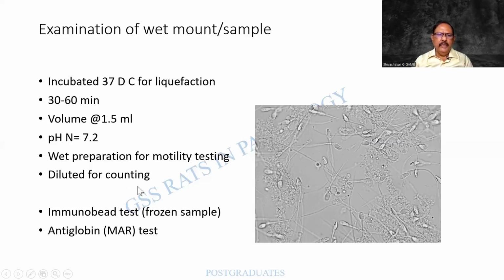And diluting is used for counting, just like any of the RBC or the WBC count. And these are tests for the immunology, immobilization test, immunobead test, or the MAR test. You people will have to mention all these things.